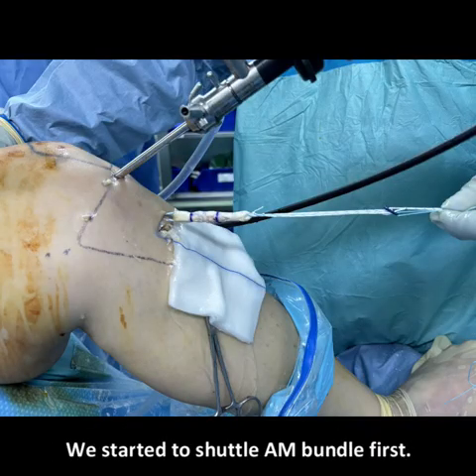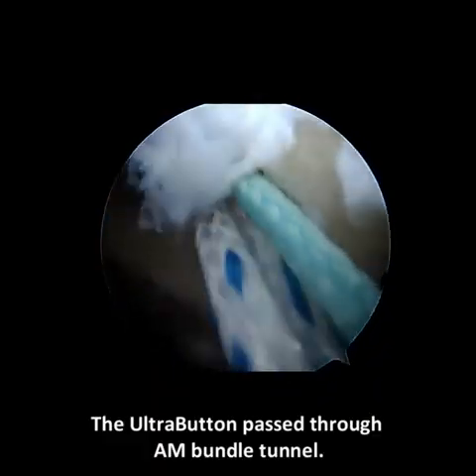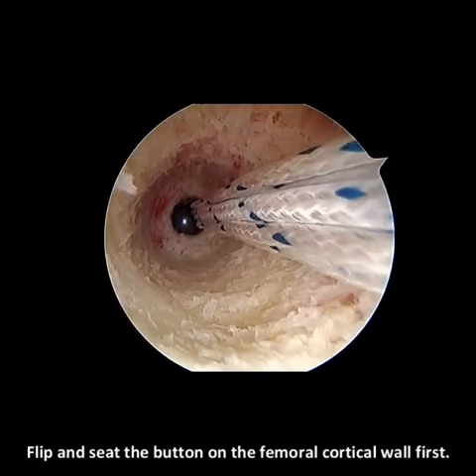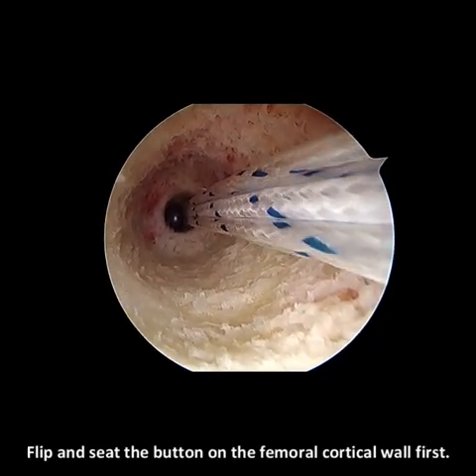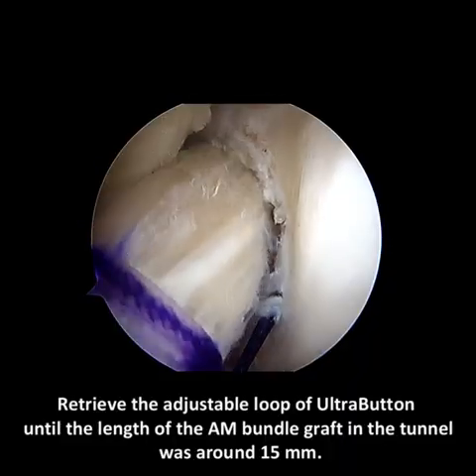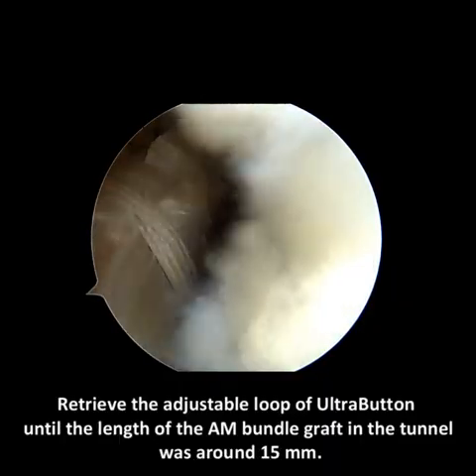We started to shuttle the AM bundle first. The ultrabutton passed through the AM bundle tunnel. We flipped and seated the button on the femoral cortical wall, then retrieved the adjustable loop of the ultrabutton until the length of the AM bundle graft in the tunnel was around 15 mm.